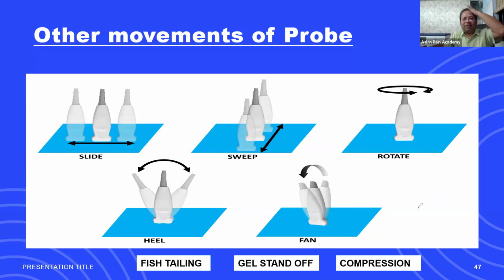Compression is nothing. You can compress and see whether it is an artery or a vein. Two vessels look the same, but a vein is compressed, an artery is not compressed. An artery is pulsatile instead. So you can know whether you are pressing an artery or a vein.